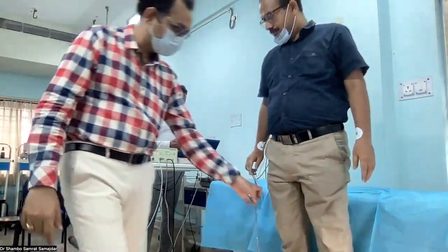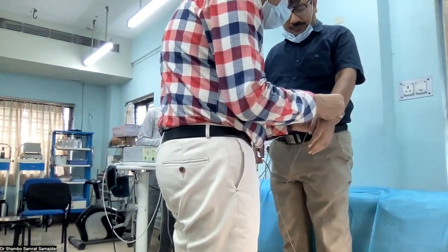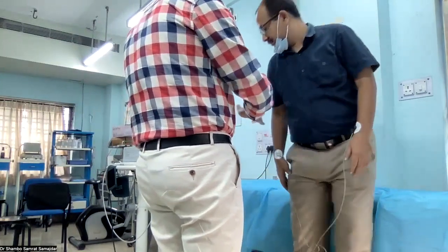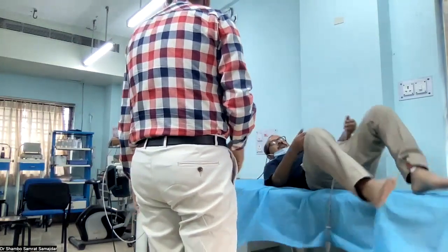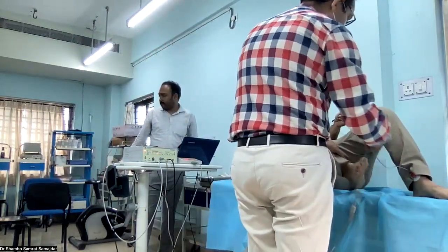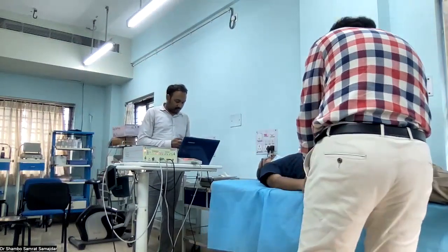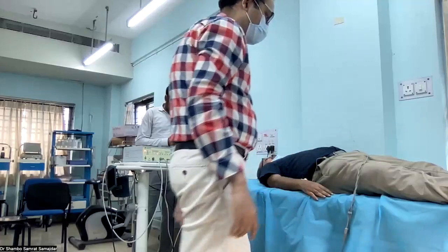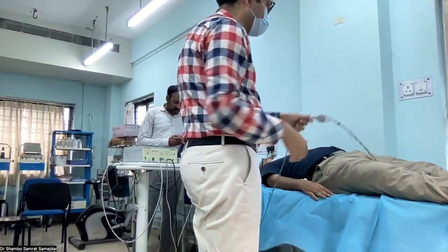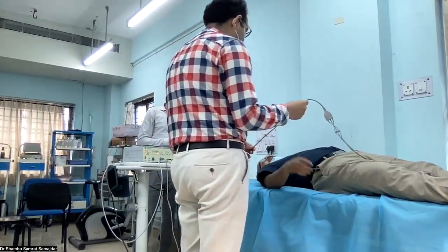So there is some issue, the lead is off, okay, no problem. So let's please again lie down so that you need to repeat stand up, because otherwise okay. Now please stand up. No, not now, lie down a bit earlier. Okay, resting. So sometimes we need to repeat because these leads could be displaced. No problem. No problem.